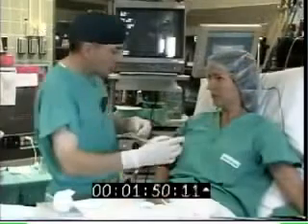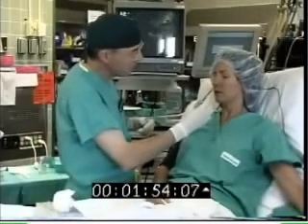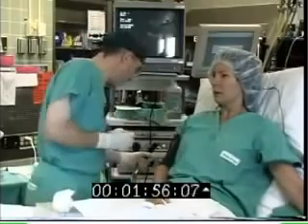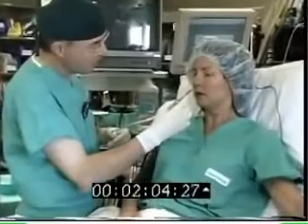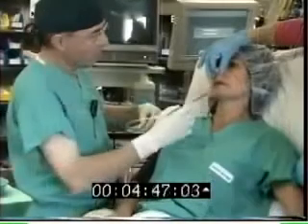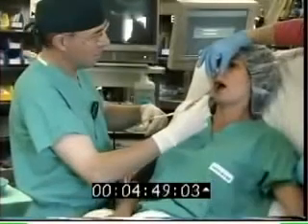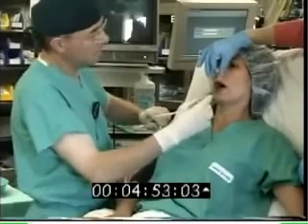If nasotracheal intubation is anticipated, the application of the local anesthetic should begin with the selected nostril. The DeVilbiss atomizer is applied with the patient's breathing in a coordinated fashion as shown in this video. If an orotracheal intubation is anticipated, the DeVilbiss atomizer should be applied through the oropharynx with the nose closed as shown.